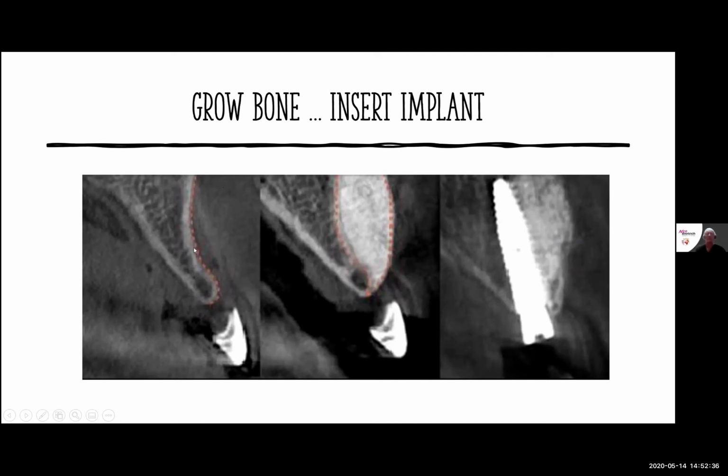And with this blood supply that's coming in here, this is supplying and growing this new bone in this area. And so we can now create space that we want to have. We can create width that we want to have. If we need to create some more height, we can get some height. I'm not going to tell you you're going to get 8 to 10 millimeters of height with that. So please don't think that. You can get 2 to maybe 3 millimeters of height with the sponge bone and with packing over the ridge.